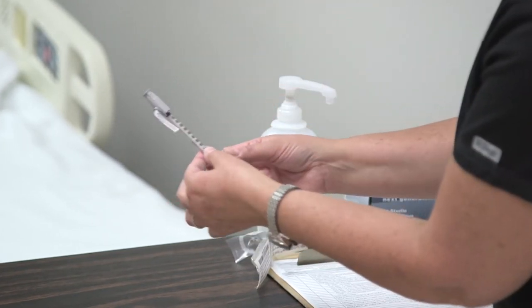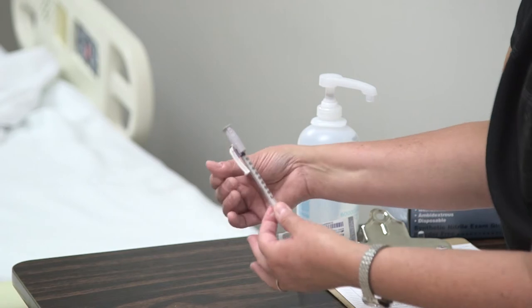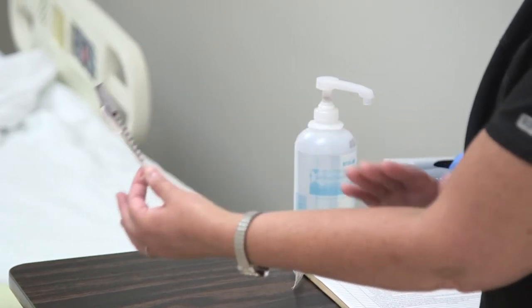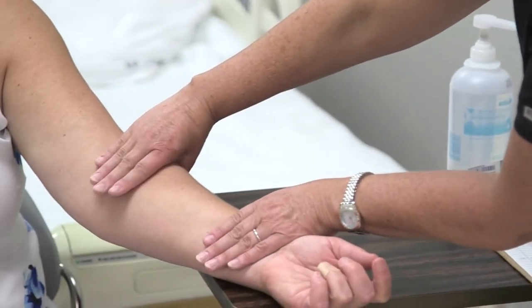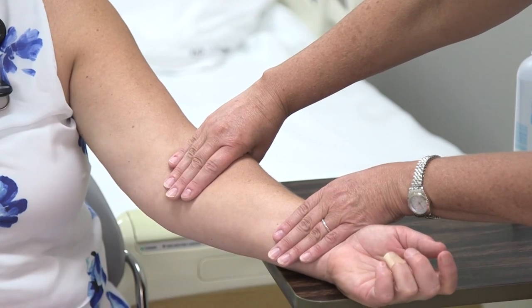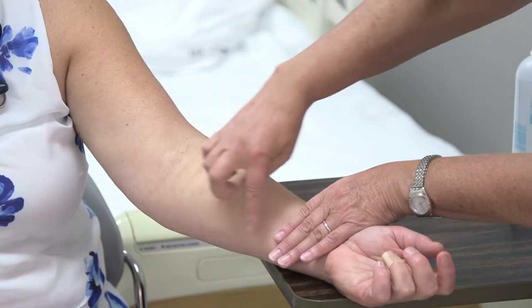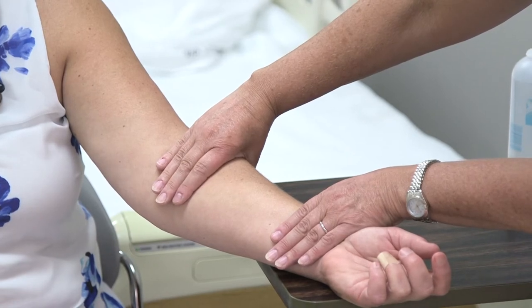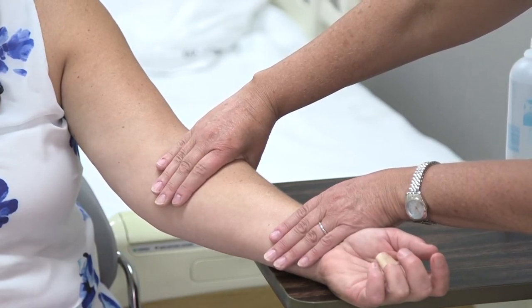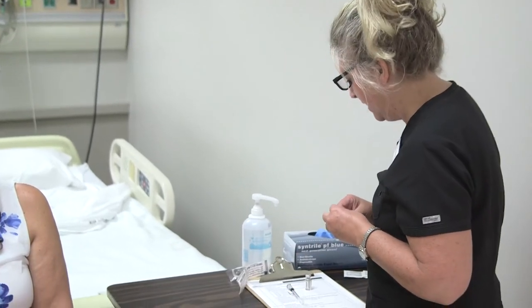Once we're ready to draw it up, for a PPD or TB test like we're doing now, our site of choice is the forearm. You can use your fingers to draw an imaginary box on the forearm — that is approximately where you give it. The other site you may see for intradermals is between the scapulae, or shoulder blades, though that is used mostly for allergy injection testing.